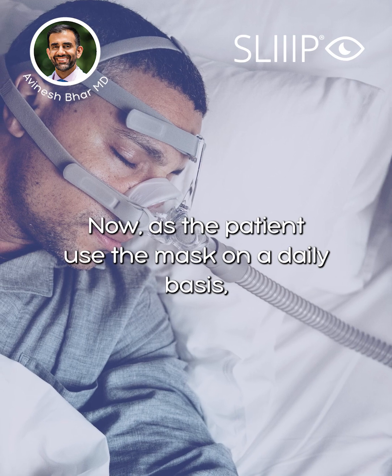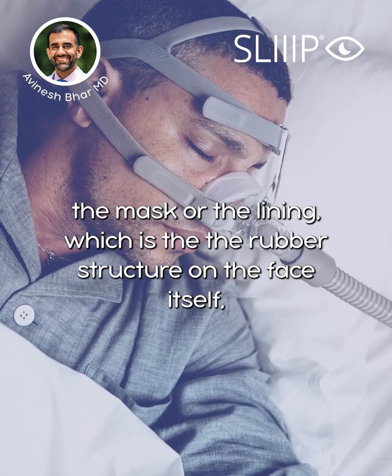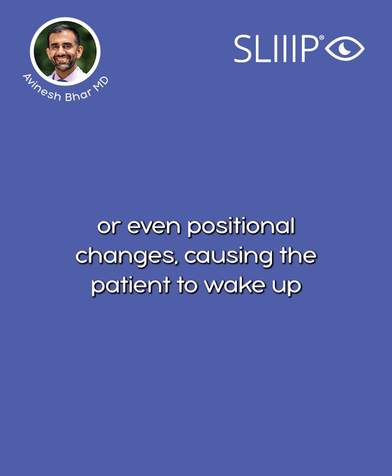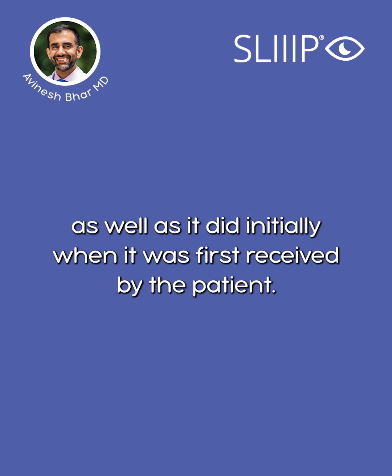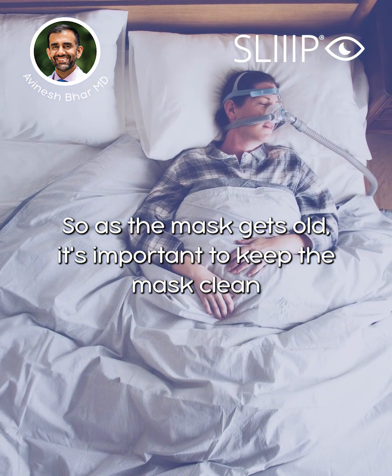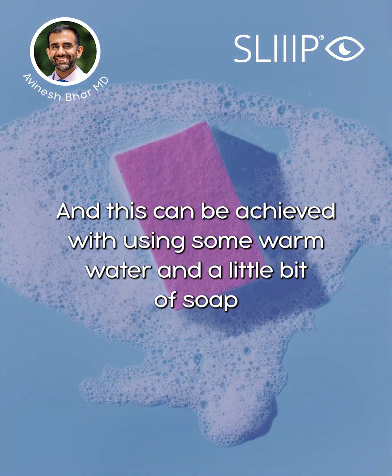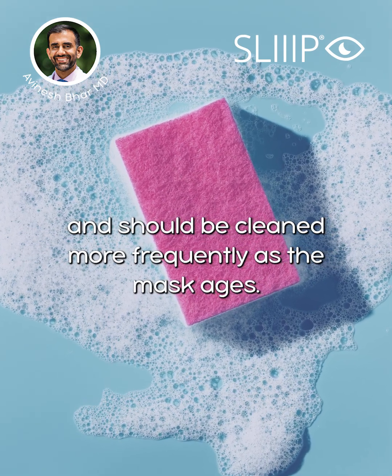The age and care of the mask is important as well. Now, as the patient uses the mask on a daily basis, the mask lining, which is the rubber structure on the face itself, may weaken and slip and slide as pressure changes occur with an auto-PAP machine or even positional changes, causing the patient to wake up repeatedly due to mask leak, as the mask doesn't adhere to the face as well as it did initially when it was first received by the patient. So as the mask gets older, it's important to keep the mask and the lining clean, and this can be achieved using some warm water and a little bit of soap, and it should be cleaned more frequently as the mask ages.